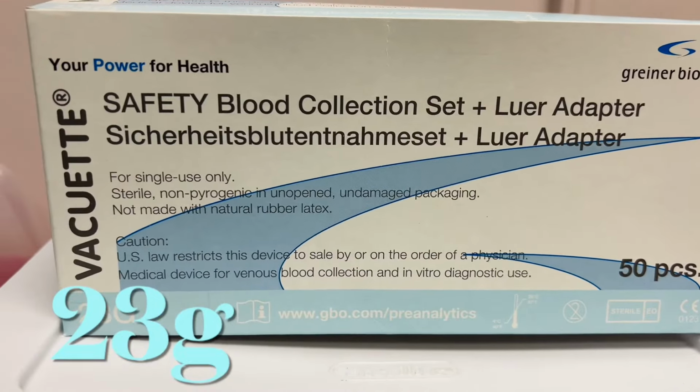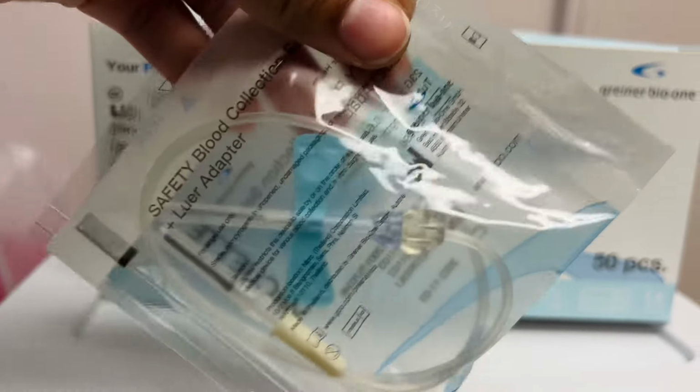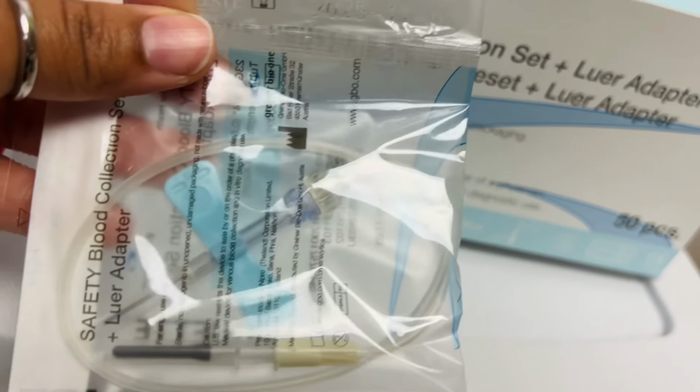So this is our prominent butterfly needle. This is a 23 gauge, which is normally used on very thin, fragile, very small veins where you cannot use a bigger needle gauge to get a full successful blood draw. The 23 gauge is normally used on my neonates, my infants, very small children, and some of my geriatric patients with very fragile veins and very fragile skin. I have used 23 gauges on adults as well, because some people just don't have great veins. So the 23 gauge just gives you that comfort. It's very small, but enough to get inside of a smaller vein versus a 21 gauge. Your 23 gauge is going to come as a butterfly.